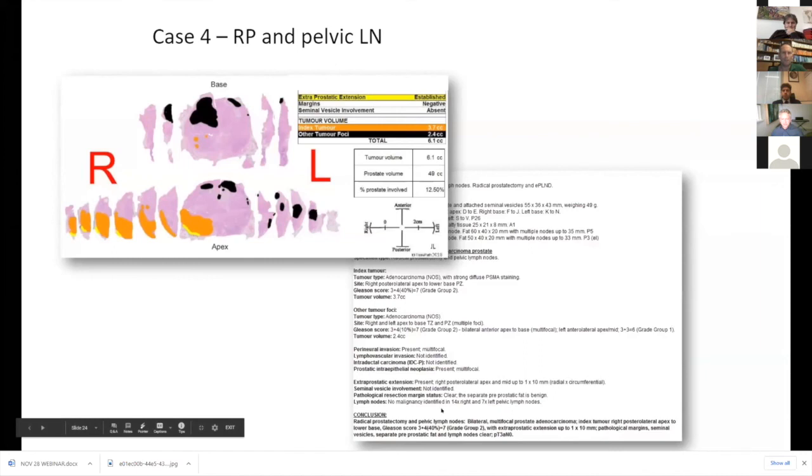Again, you did lymph nodes, obviously, from the 4+3 and the higher grade group, but they were negative. Negative. Extraprostatic extension was present in that posterolateral area, but not anteriorly. I think the correlation, as you mentioned, is just so precise. Now, when I say that, we're factoring in, of course, that the tumour does tend to be bigger in real life than it looks on the MRI.